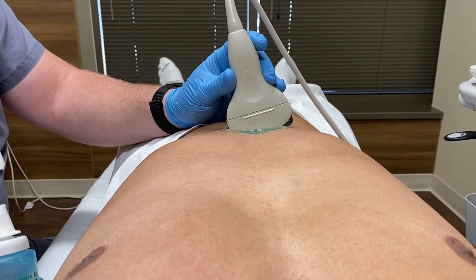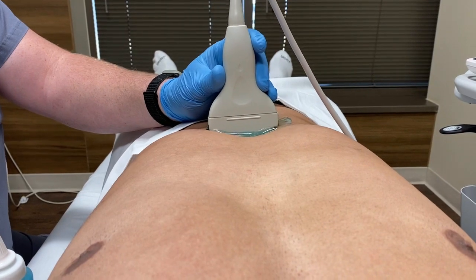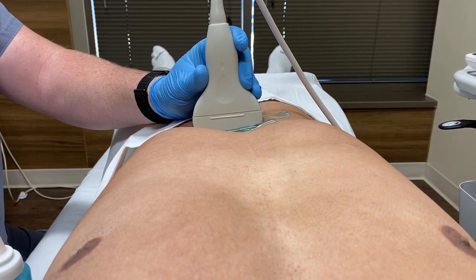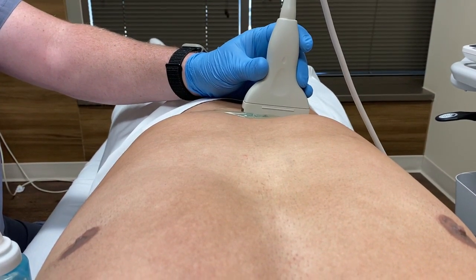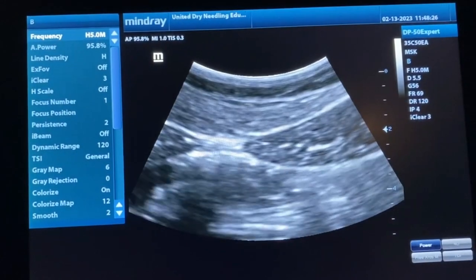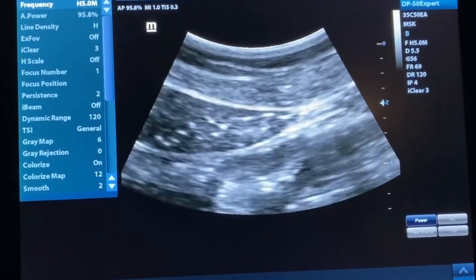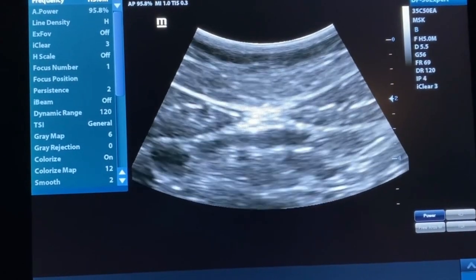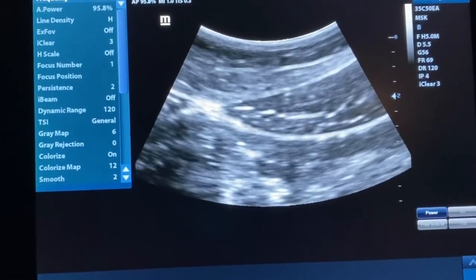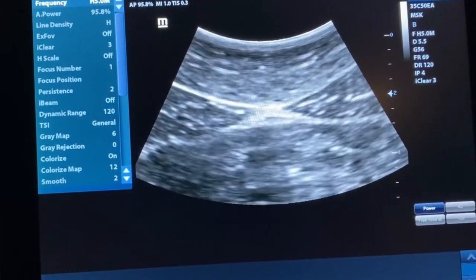First, we'll look at some basic ultrasound scanning technique for the rectus abdominis. We start in the midline of the rectus at the linea alba, and then we move over laterally to the left side of this gentleman's rectus head, and then we'll look at the right side of the rectus head. Now you can see it on ultrasound — you can clearly see the rectus abdominis, the linea alba in between, and the other side of the rectus abdominis. We just rock the ultrasound transducer so we can make out a clear image and see the layers, and then we'll freeze the frame to analyze exactly what the layers look like.